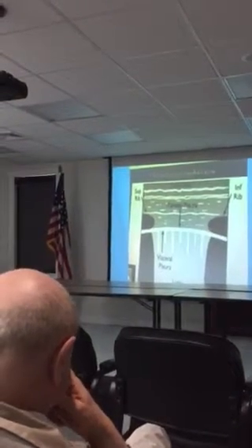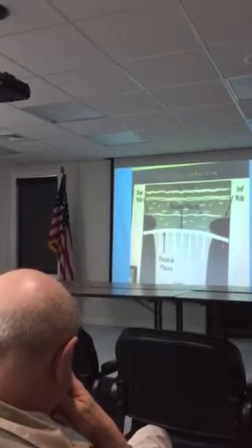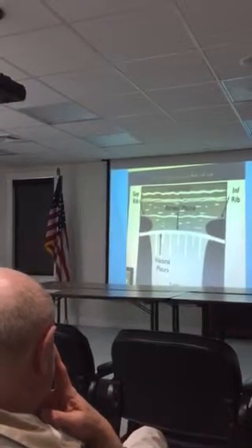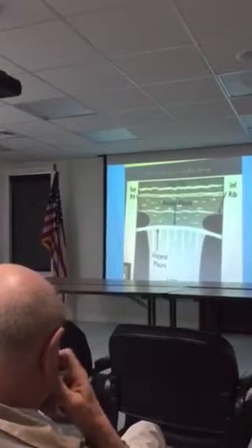Here we go, so this is the rib, and this is the rib. Behind the ribs here, because it's a good window, this is reflection, you can see it dark like this, that is the acoustic shadow, and this is the pleura here. It's going to be hyperechoic, bright, and this is the chest here, this is normal.